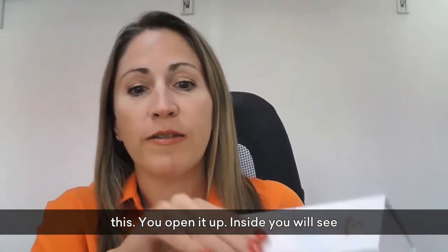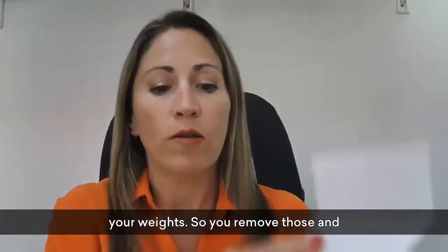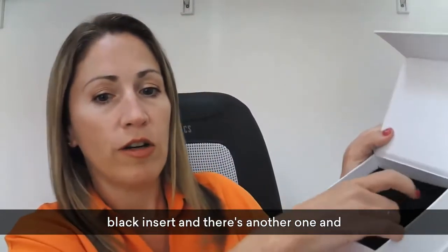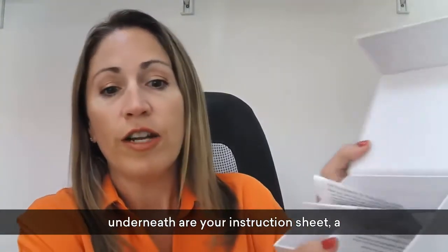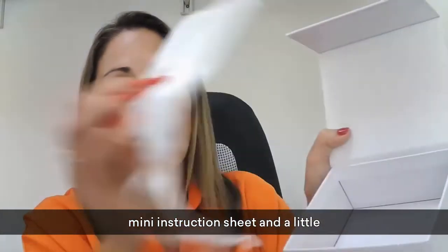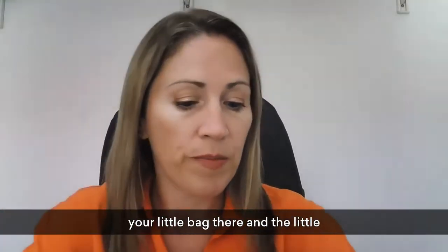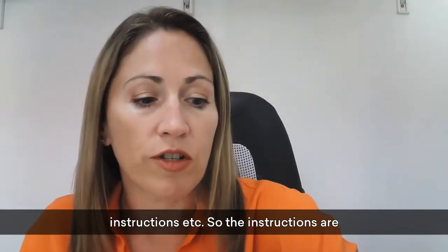You open up the box and inside you can see your weights, so you remove those. Underneath there's a black insert — there's another one underneath — and under that are your instruction sheet, a mini instruction sheet, and little bags. You can take these when you go out for the weekend, to your yoga class, pilates class, or the gym. You've also got little cards designed to go inside to remind you of where you are and the instructions.